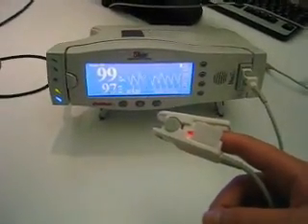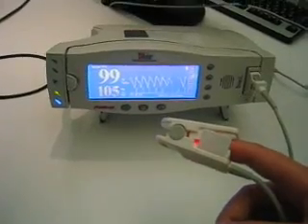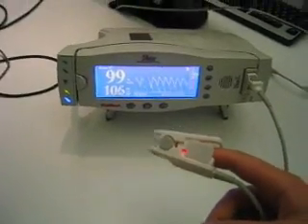Did you know that you can change your heart rate by holding your breath? Yeah. Wow. This is bad.